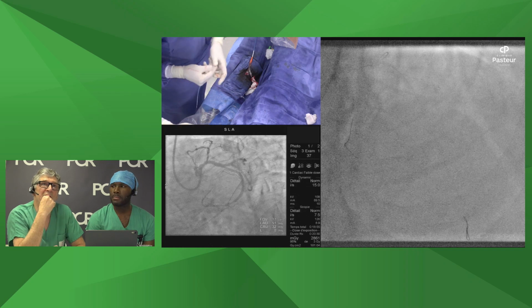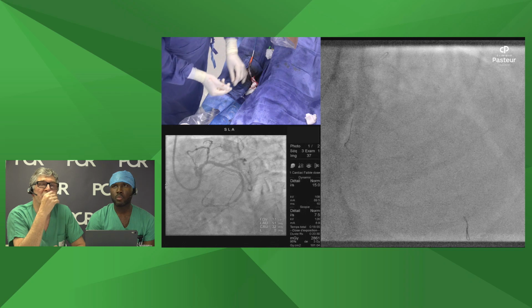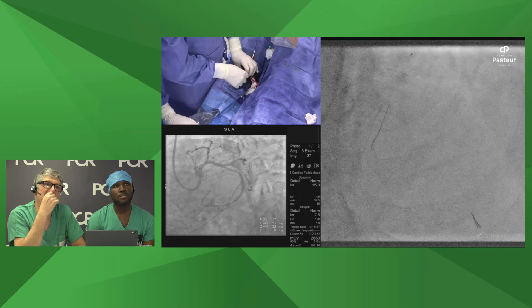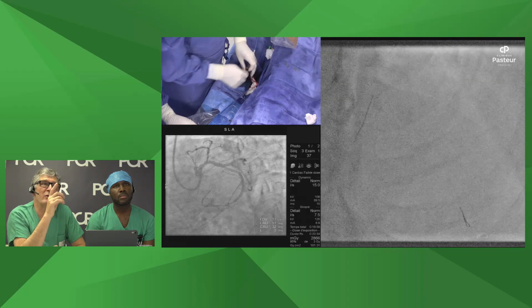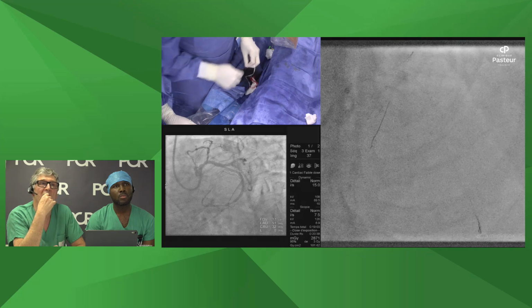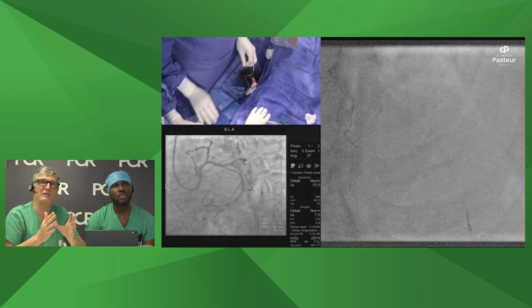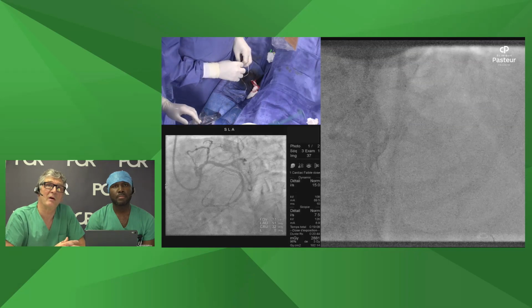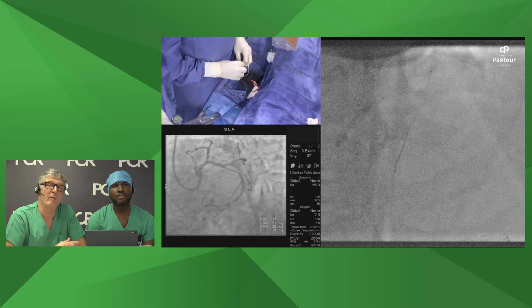What is very interesting is that we have seen on the StentBoost or stent vis that you had a different size also in the left main. So the stent in the left main is a little bit larger than in the LAD, just because there is no resistance to oppose to the stent, because the vessel is at least 4.5.